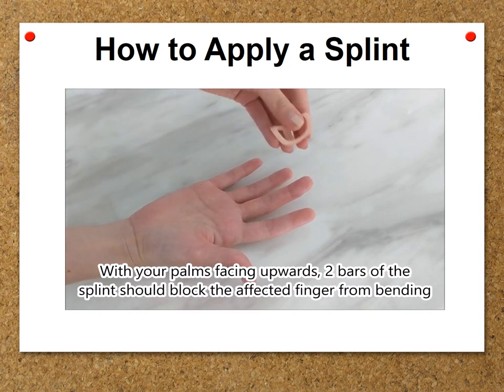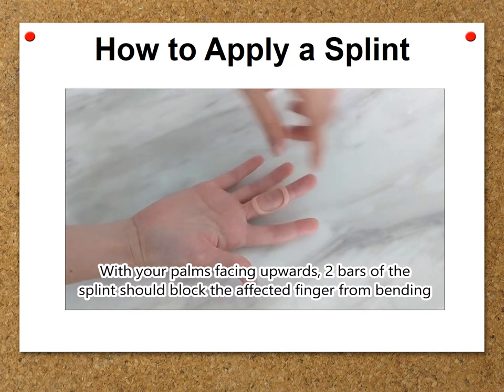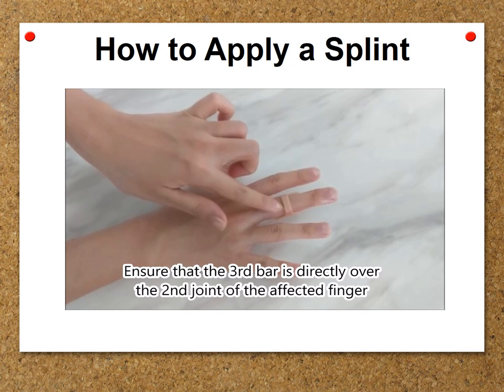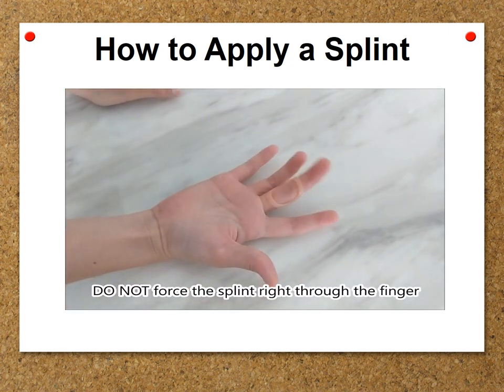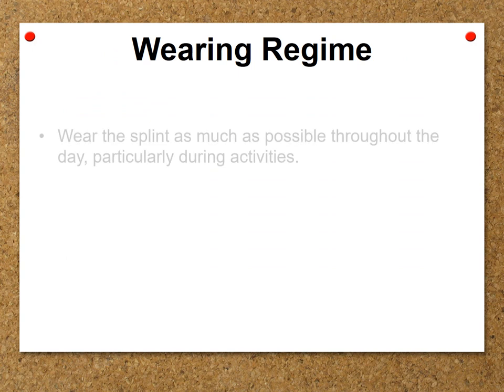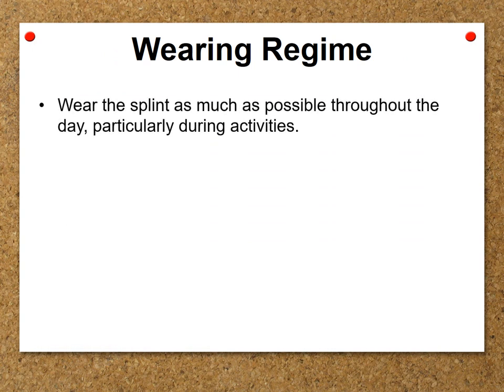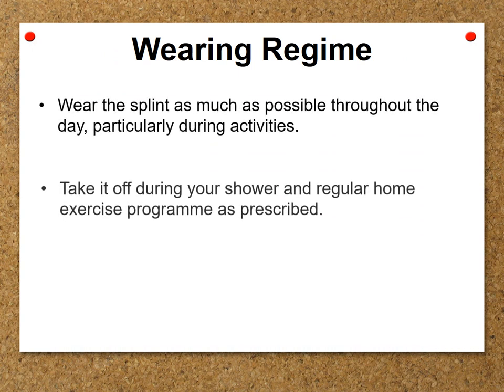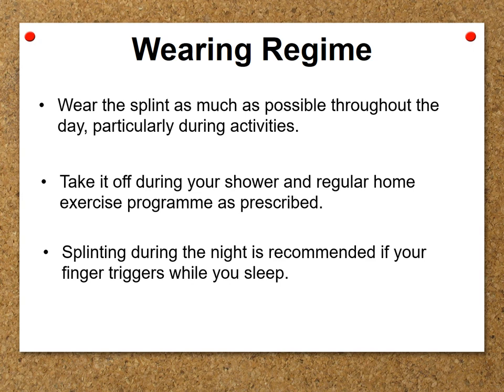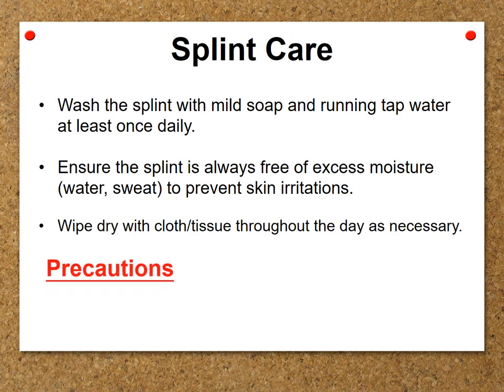With your palms facing upwards, two bars of the splint should block the affected finger from bending. Ensure that the third bar is directly over the second joint of the affected finger. Do not force the splint right through the finger.